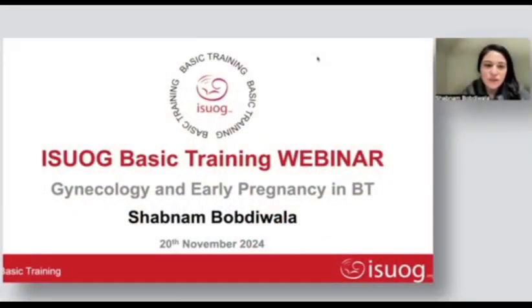Hi, everyone, and thank you so much to the committee for the invitation to speak to you today at this basic training webinar on specifically the gynecology and early pregnancy component of basic ultrasound training, which I've been quite heavily involved in, and it's been a real passion of mine over the last few years.